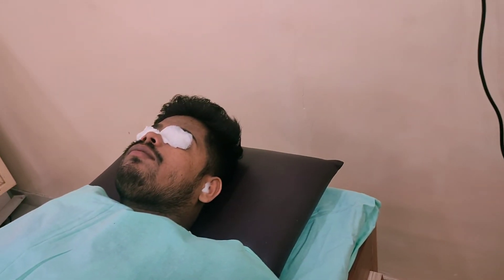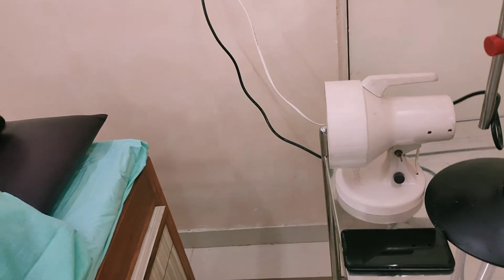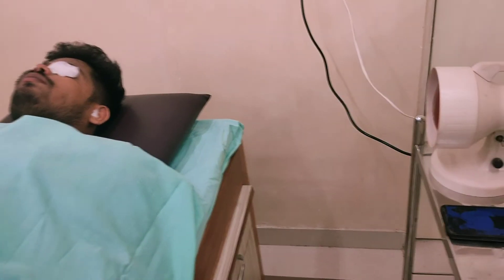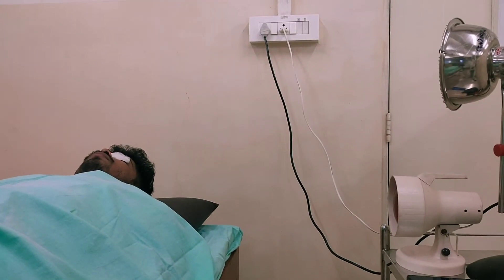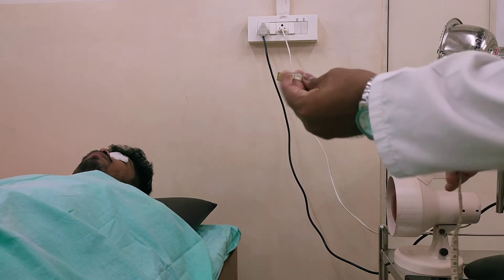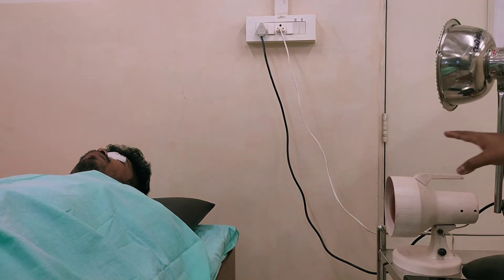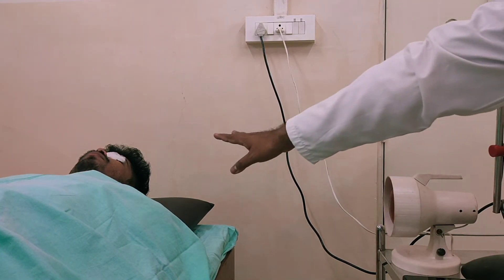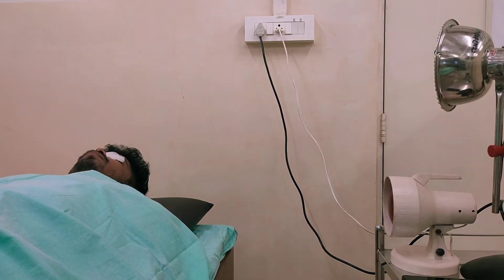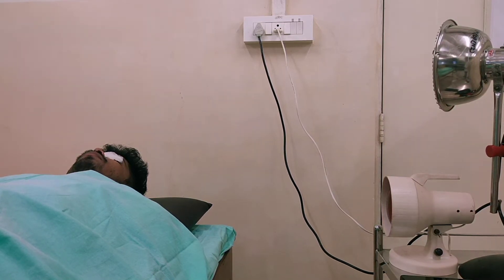The area of application has to be exposed. Now, the distance between the generator and the face should be 50 to 75 centimeters. With the help of a measuring tape, you can measure the distance between the face and the generator. The generator should always be perpendicular to the body tissue, as this is a superficial thermal modality.